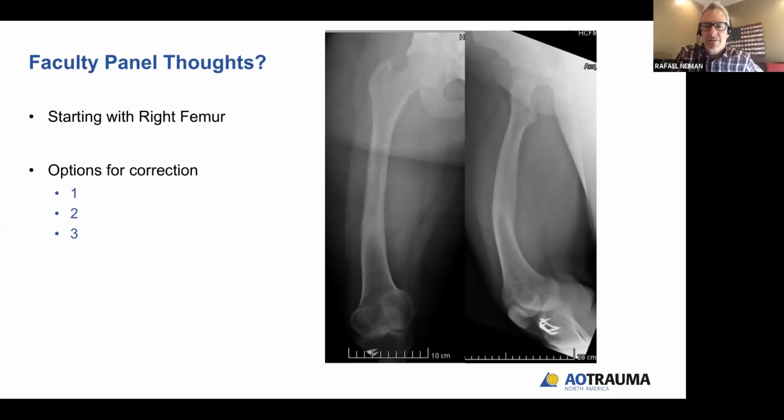Yeah, those are great points. I would think that you need to work with endocrinology to make sure, as orthopedists, we're just not experts in that. On the canal, if you look at the literature for Sofield osteotomies, there are some percutaneous modifications, but still, when you look at the case examples of severe bowing, they do use small caliber nails. Some of those studies are historical, but even doing them now, they still use very small caliber nails, and some of them aren't even locked.